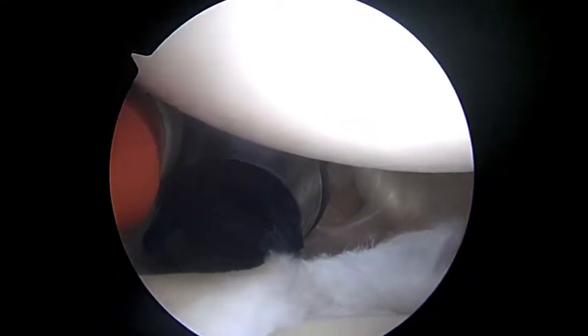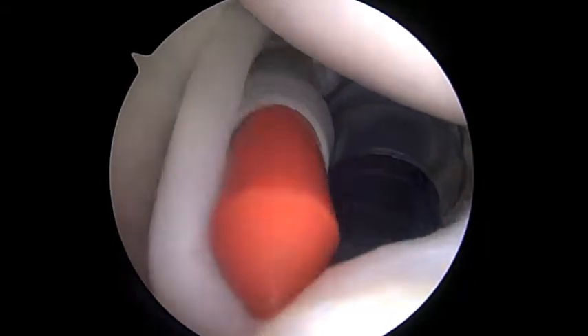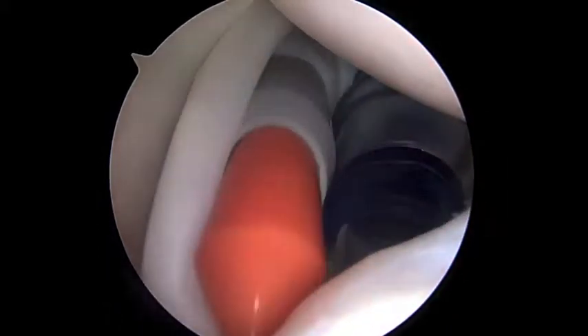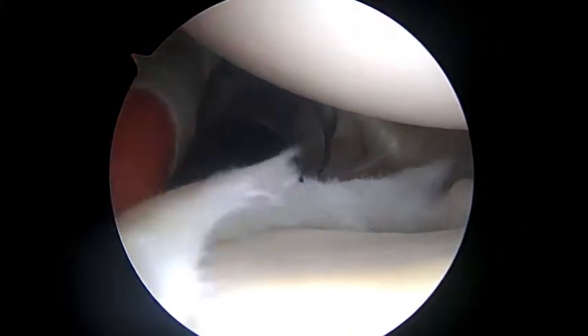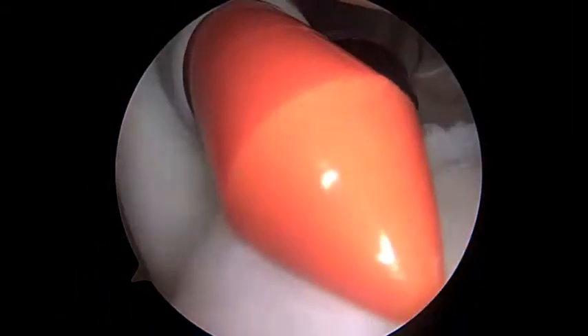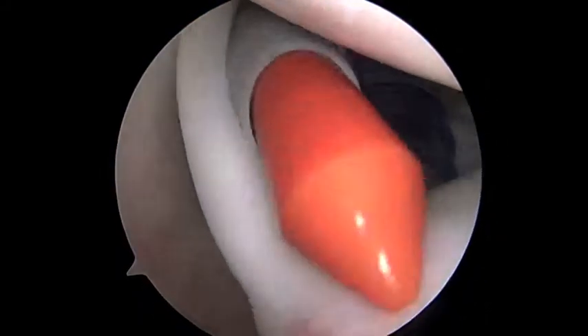We're getting our first look from the back of the shoulder towards the front. You can see we've got two cannulas coming in the front — a blue plastic one and a gray plastic one. With this gray one, we can tug on the biceps tendon. The tendon's on the left side of the screen, and as you tug on it, you can see what we call a SLAP lesion. This Type 2 SLAP lesion goes along with instability often.